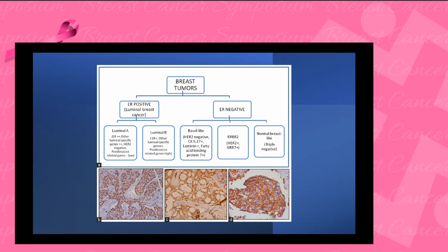So I remember when we trained, we were just grading them histologically, and we were not going into molecular classification. But as we evolve, and there's a lot of changes, especially in management of this patient, going towards molecular targeted therapy, it became imperative that we as pathologists also evolve and start testing this tissue for the biomarkers that are important for therapy. So you would see that these tissues will then be tested for your receptors, your ER and PR receptors, and we then classify them according to the receptor status.